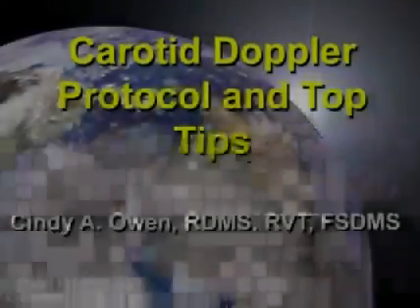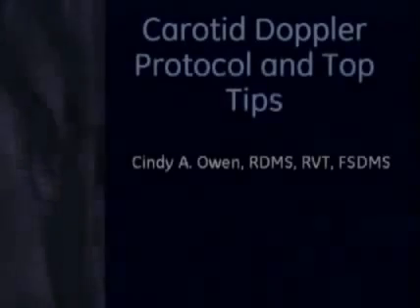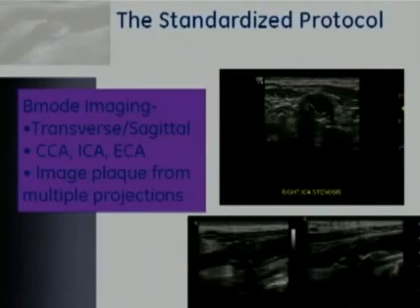I've been a sonographer for about 30 years, and currently I work with GE Healthcare as a Global Luminary and Research Manager. My topic today is carotid tips and protocol. I'm going to talk about carotid Doppler protocol and some tips for performing the exam.